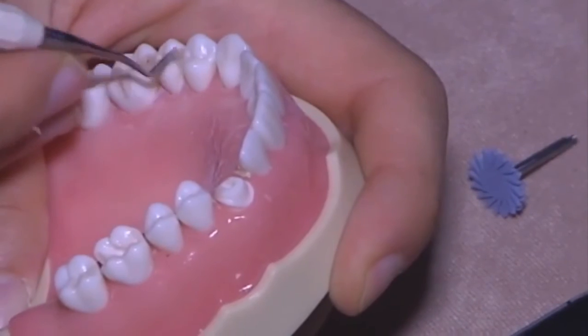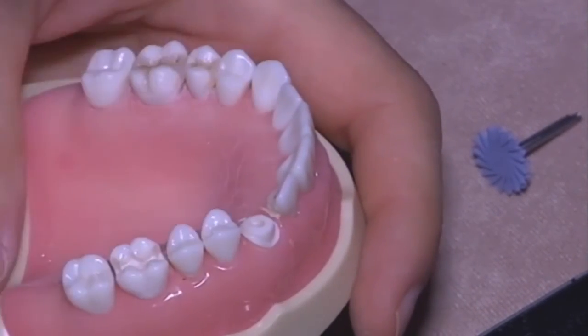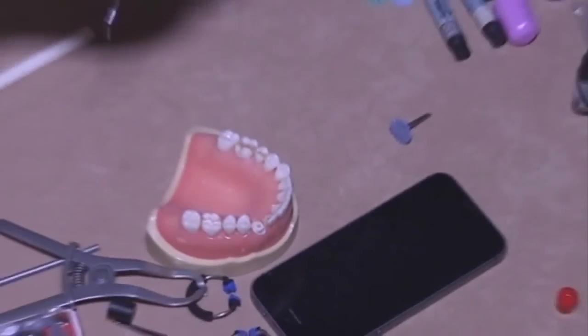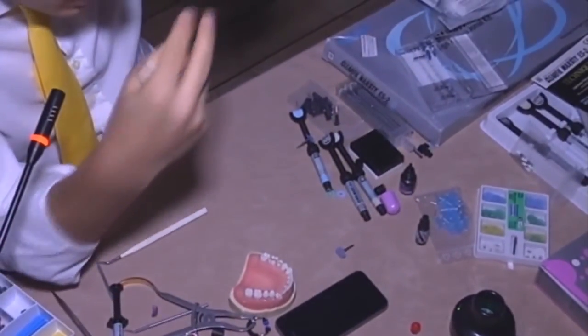you just have to pass an interproximal strip. Just cut it, divide the interproximal strips we used to have. They are too high. So my assistant, she knows, and she cuts them in two.